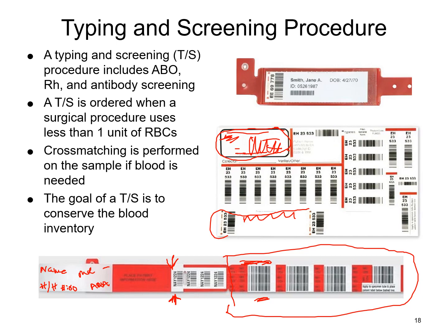But then the individual labels would go on the unit of blood, and of course they would want to match that up. So this would be an additional label to what is already on the patient, or a bracelet or identifier that's already on the patient. Typically most patients have some kind of hospital identifier, and this would be additional to that, so it'd be unique to blood bank itself.